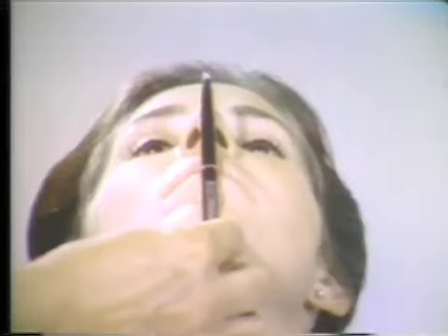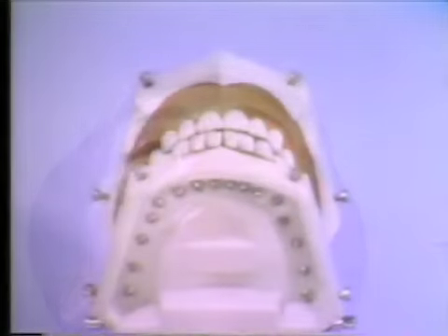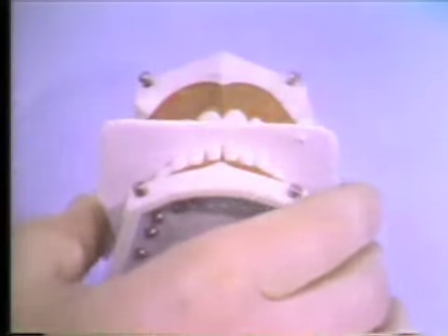For this radiograph, the patient is again positioned with her head tilted far back. In a frontal view, the mid-sagittal plane of the head must be vertical. Using the typodont for demonstration, the packet will be inserted in the mouth. The sensitive side of the film must be placed downward against the lower teeth. The long aspect of the film will be placed from side to side in the mouth and positioned symmetrically. About 1/4 inch of the packet should protrude anteriorly.